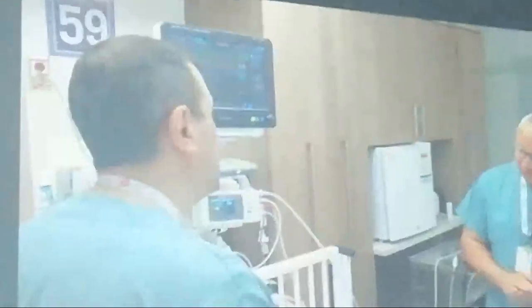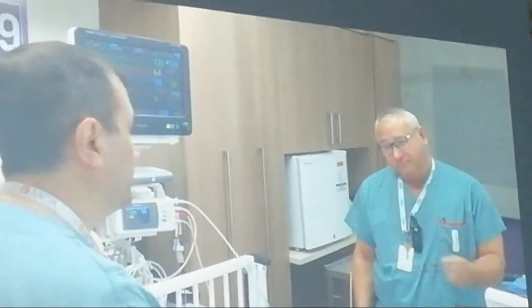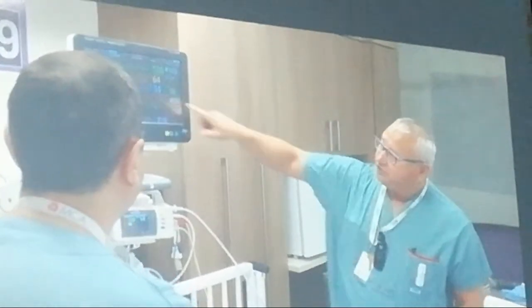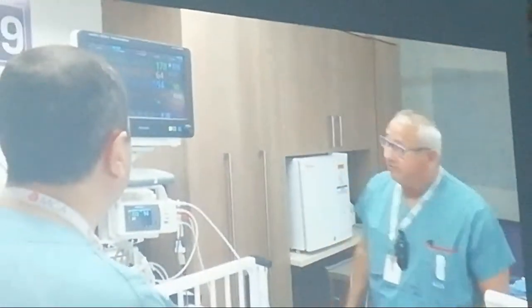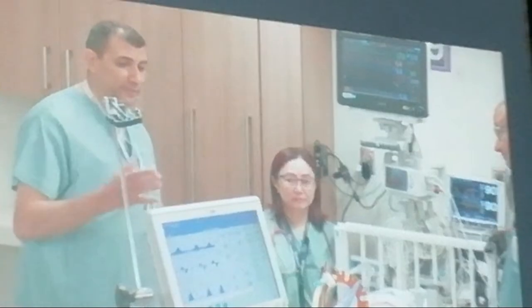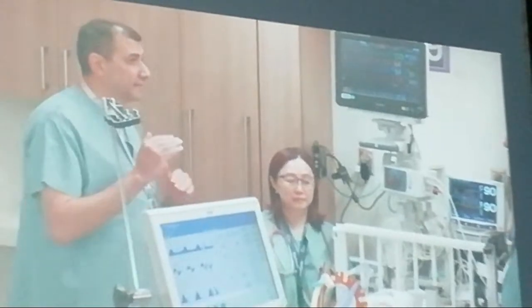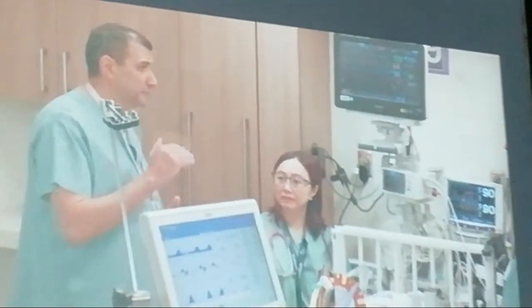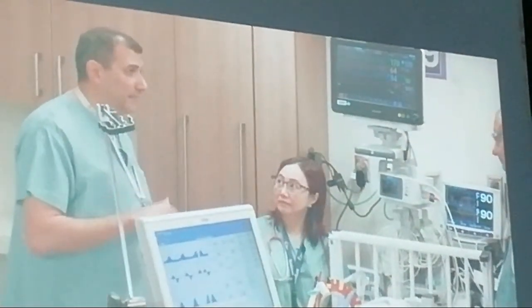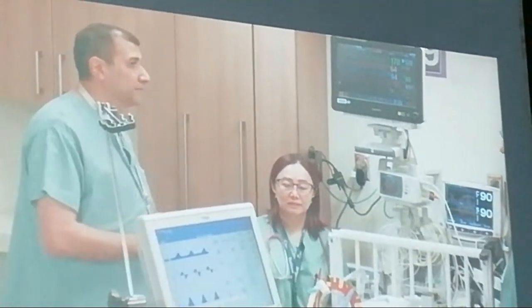The oxygen reduction test that I'm going to do with you is I'll just reduce the FiO2 by about 2% every 5 minutes. And we're going to watch the saturations. What target would you like me to keep the arterial saturation above? We can continue weaning the oxygen as long as the oxygen saturation is above 85% and the brain oxygen saturation is above 60%. Then we should stop weaning the oxygen if the oxygen saturation drops below 85%.